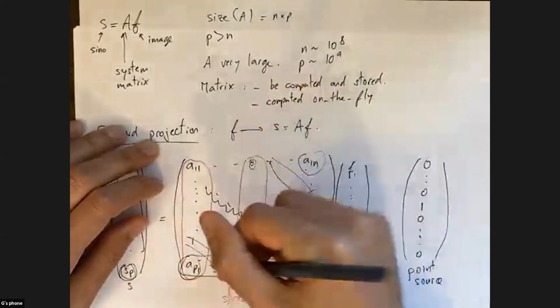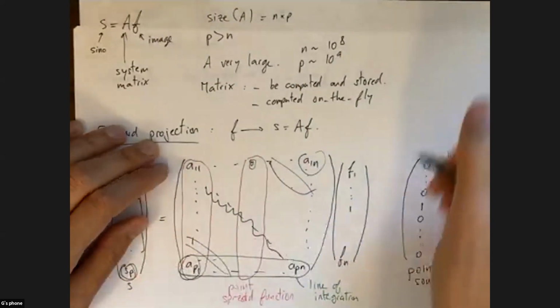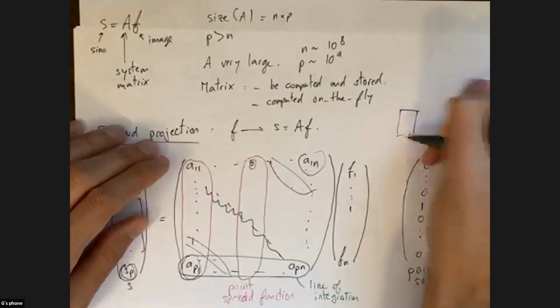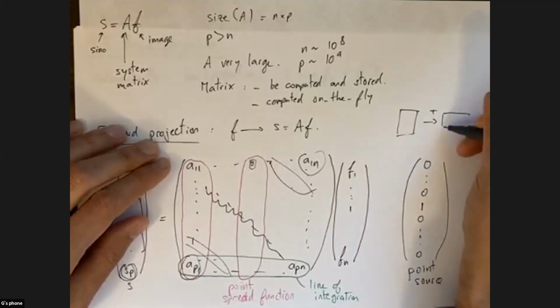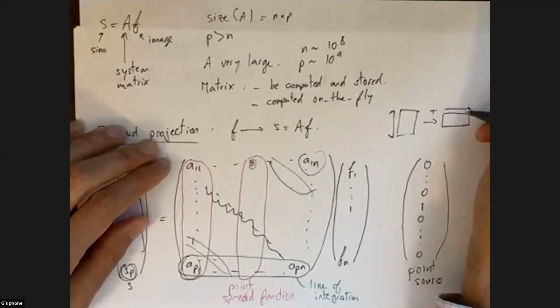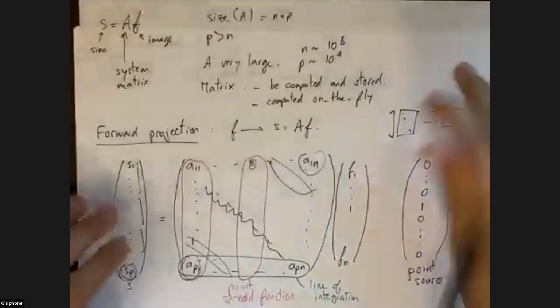The whole matrix is being flipped along its axis, so that if the matrix originally was long and skinny like this, after the transpose operation it is going to be short and fat. So the matrix is being flipped along its diagonal, essentially. I mean, it doesn't have a diagonal, but it's being flipped.